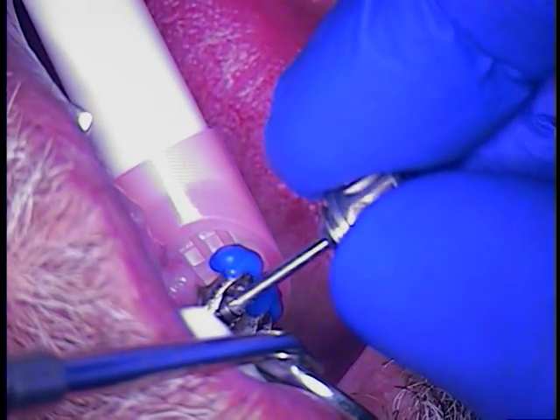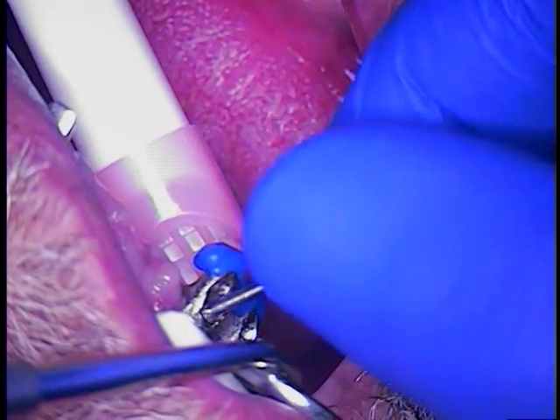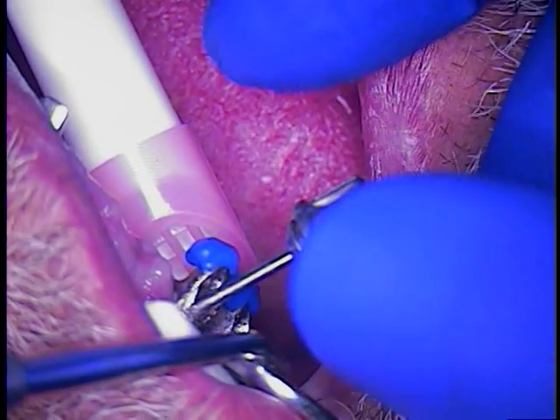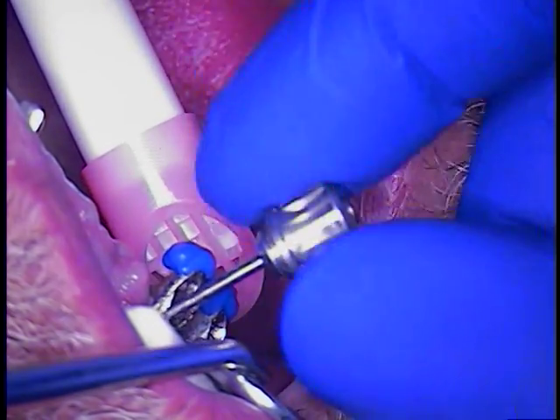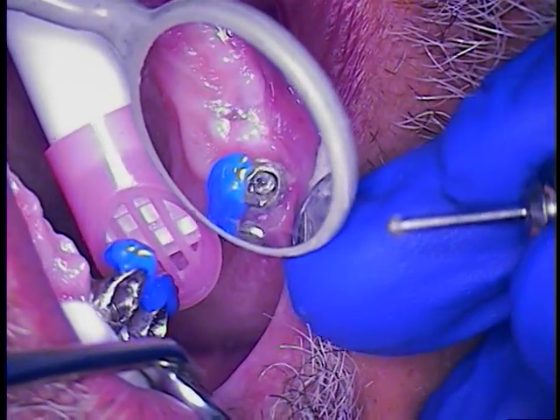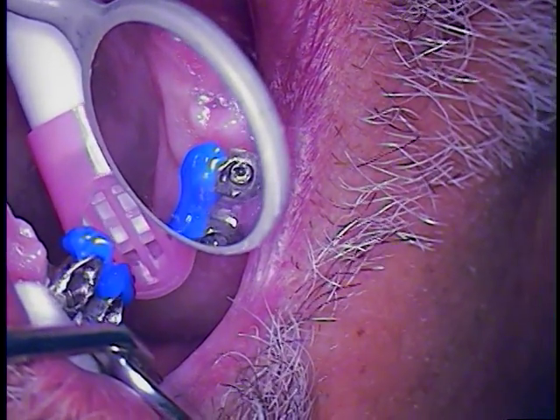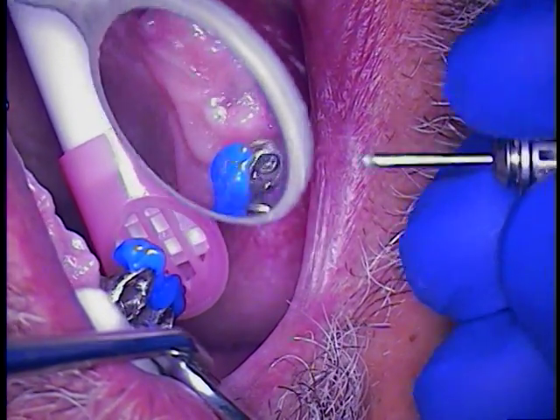And slide that in like that. And just literally gently watch it go in. Alright, so that bottomed out, so we know that we're just going to hand tighten this.